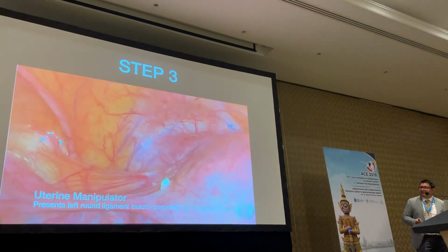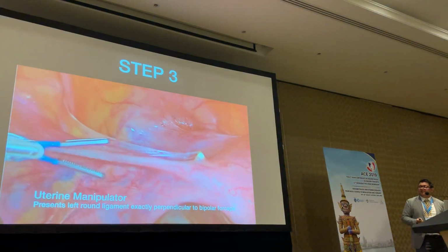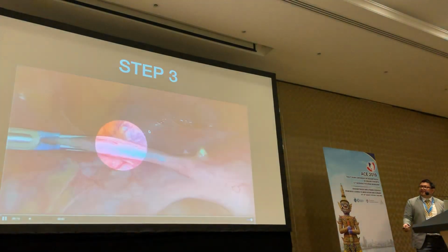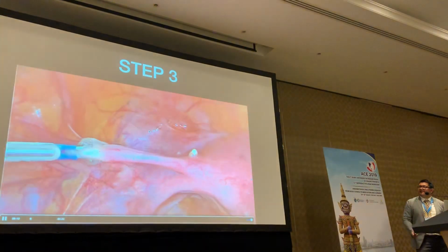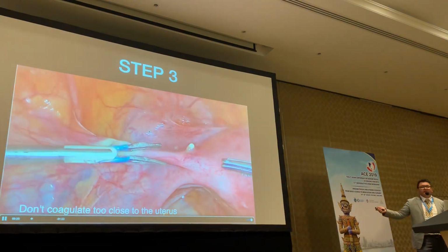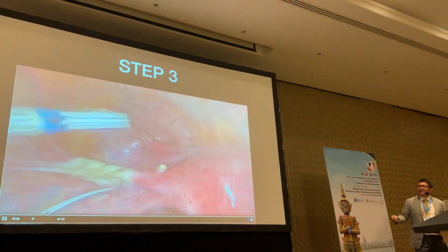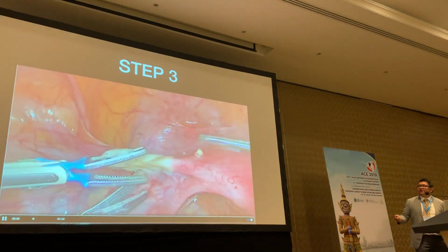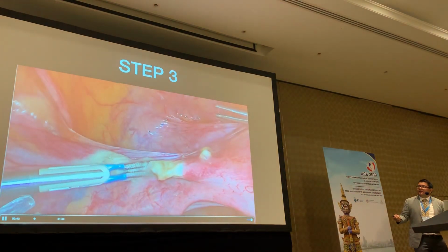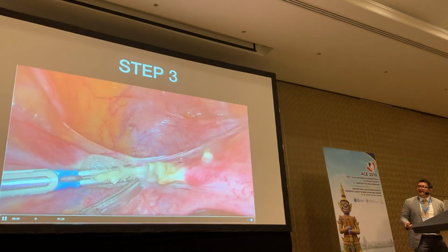Now, coming to the manipulator, it pushes the uterus anteriorly and then towards the right, which produces round ligament stretch. I approach with my bipolar in my left hand from the left lower portal, and I open in the space in this gray area between the infundibulopelvic ligament and the external iliac vessels, and don't coagulate too close to the uterus. I will, just to take care of any retrograde bleeding, but I do not cut that. So the more you put this on stretch, the more space you get. Of course, in larger uteri, you might have to go a little more lateral. So don't cut more than you coagulate, and your bipolar is always at the ready to catch any aberrant bleeders.